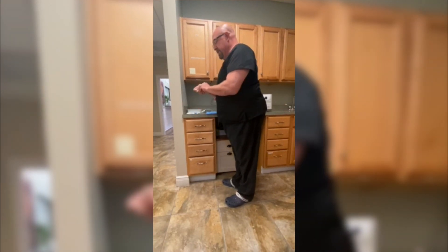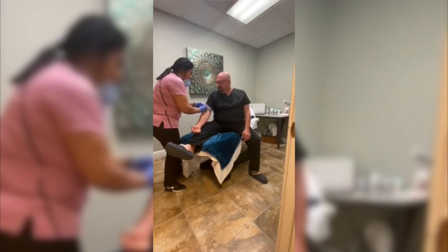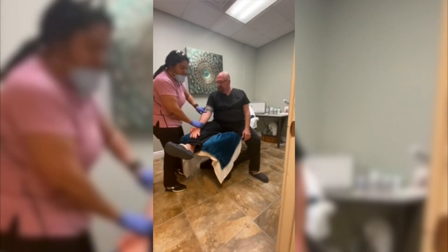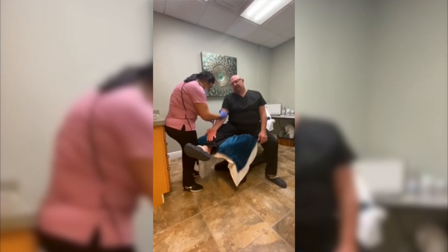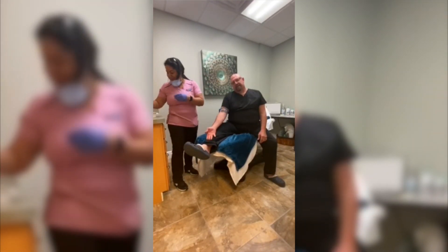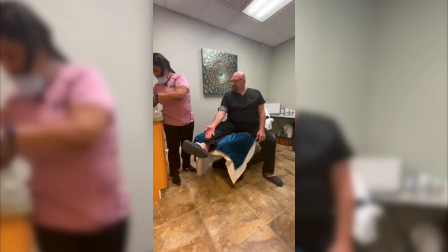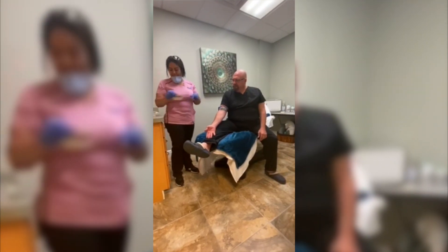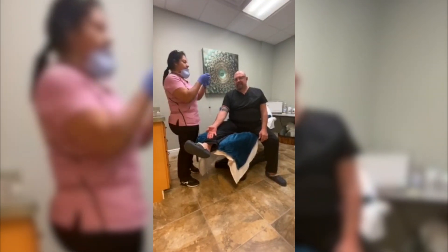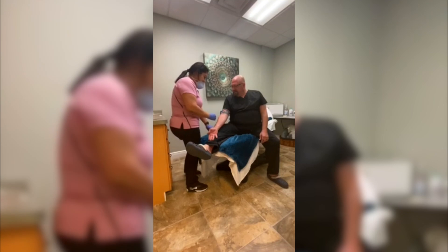We've moved into the exam room. Jennifer is going to draw my blood — we're using a 30 cc kit, which will give us five to six cc's of pure PRP. I'll explain that as soon as she draws the blood so I don't have to talk while she's sticking me, because I tend to talk with my hands and I don't want to move. She's prepping the area with an alcohol swab; you can also use something like Dura-Prep. She has a 19 gauge needle hooked to the 30 cc syringe with the anticoagulant in it and she's going to do the venipuncture.